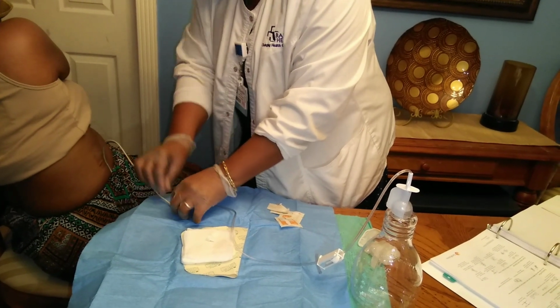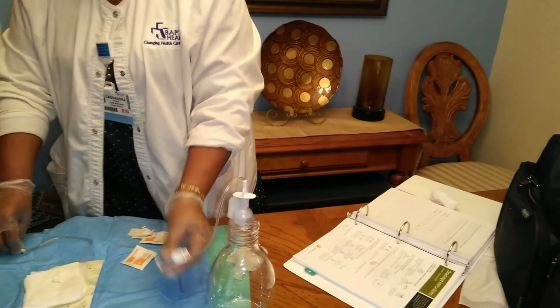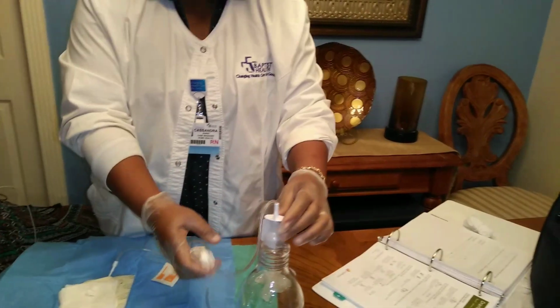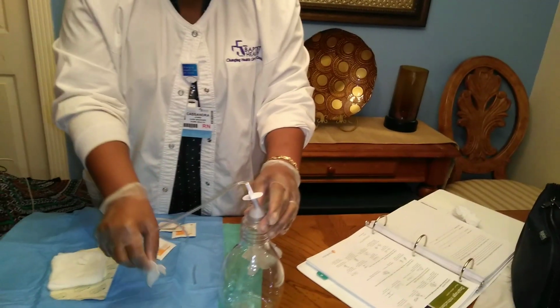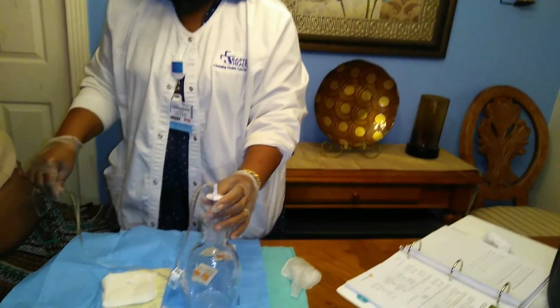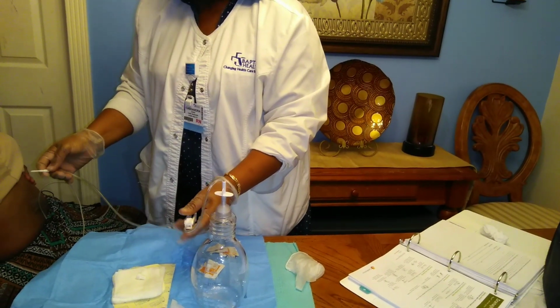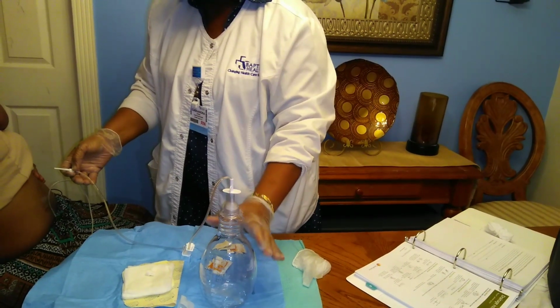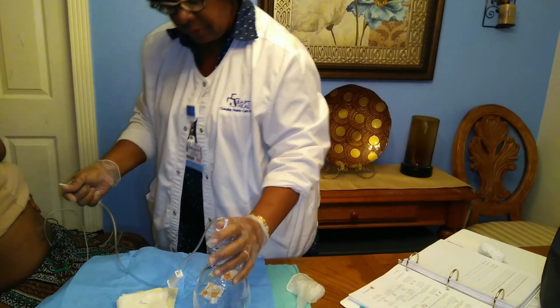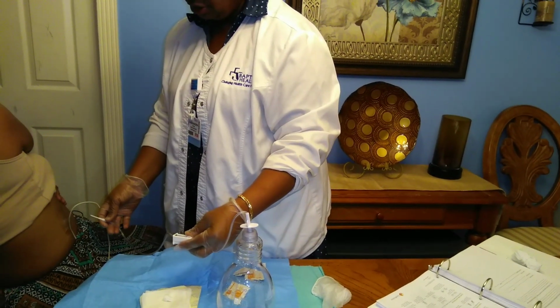That's connected there. Then what I do, I take my roller clamp. Again, I check to make sure it's down. This comes off because this is connected. Once I take that off, double checking to make sure my roller clamp is down because you don't want it to just, this is a vacutainer, so it's going to vacuum. I slowly push this down, and then I'm going to slowly open my roller clamp, and you'll see it start to drain.